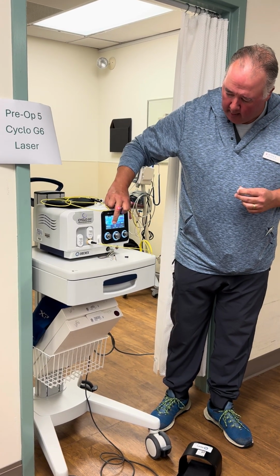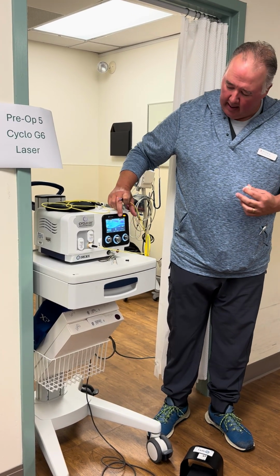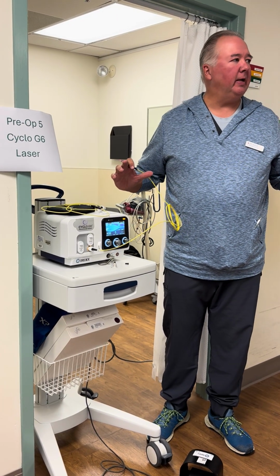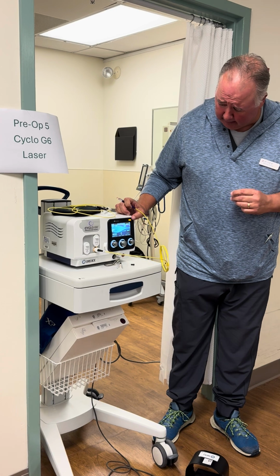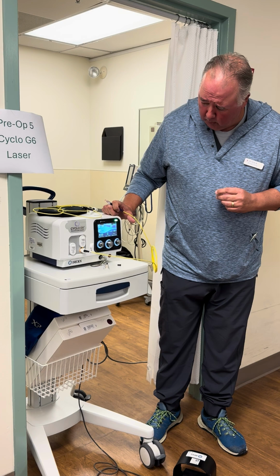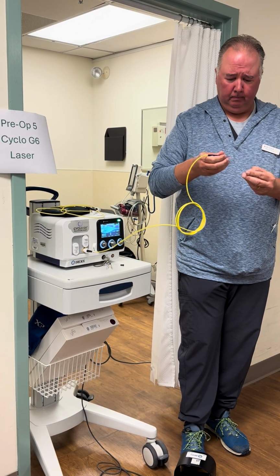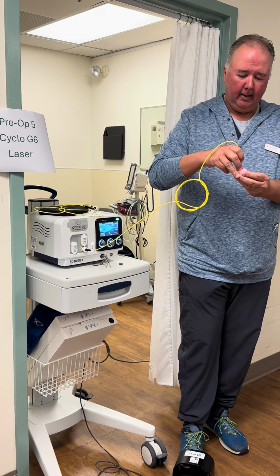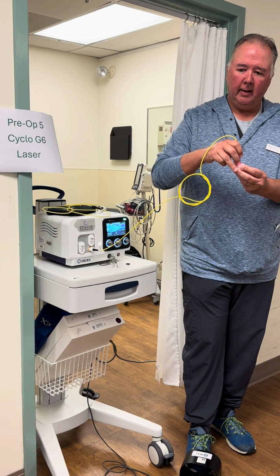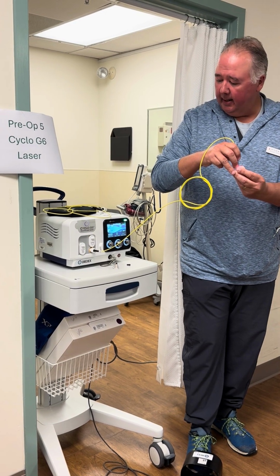This one will be 4,000 milliseconds, which is essentially 4 seconds. And the power is usually at around 1450. So it's less power, but it's longer duration. So it's essentially coagulating the tissue. So we'll go green here, and this one they just hold. They hold on the eye. It'll hum. That's one spot. Then they just move it over one. Hit it again.